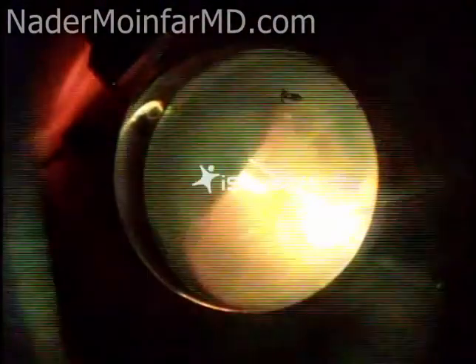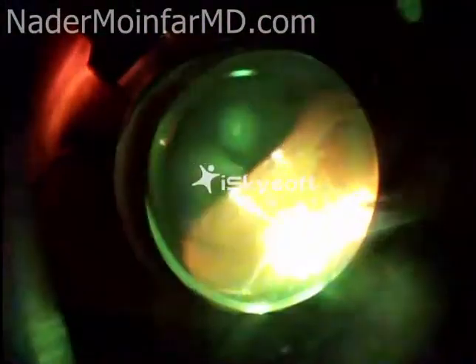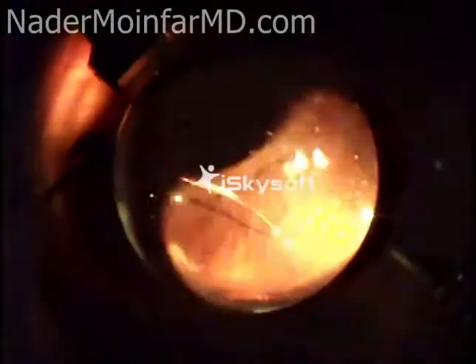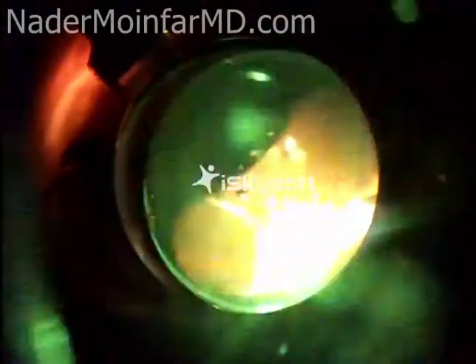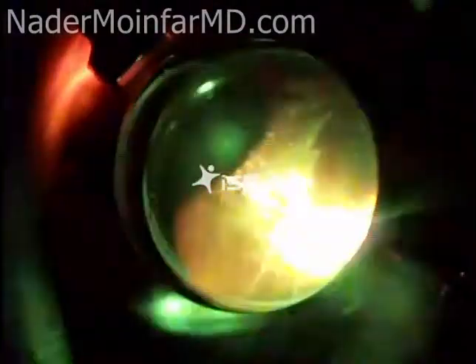After this is done the procedure is essentially completed. This is a micro incisional surgery, so the cannulas are removed and inspected for any leakage from the wounds. Typically there is not any. Antibiotics are administered and that really wraps up the surgery.